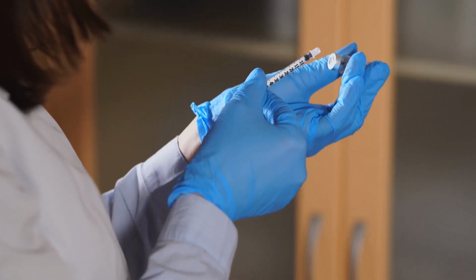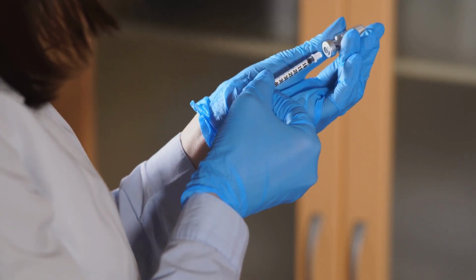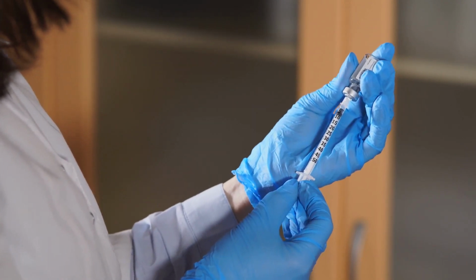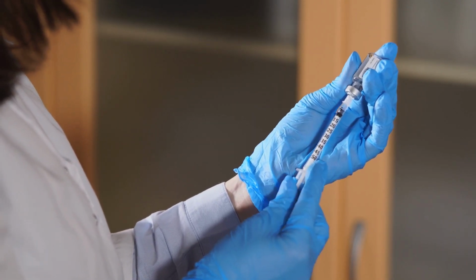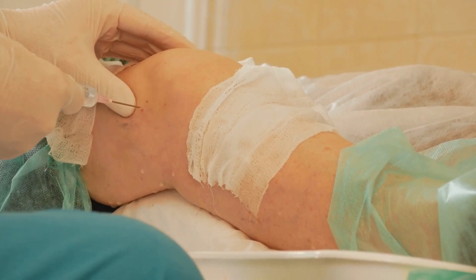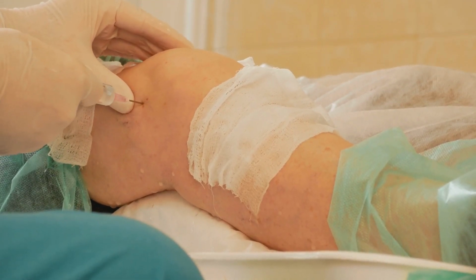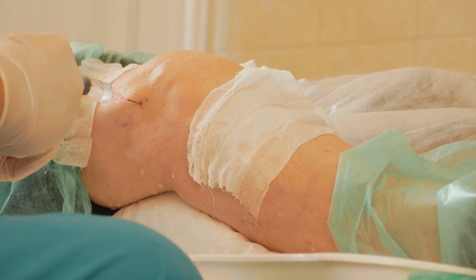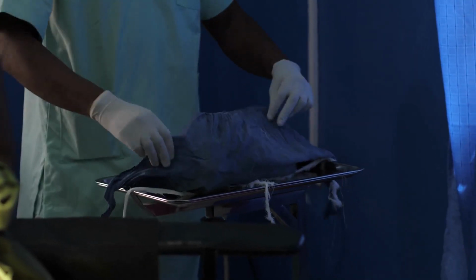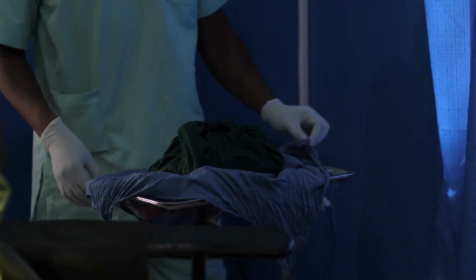The anesthetist attaches a syringe filled with air or saline to the epidural needle. As the needle is advanced, the anesthetist periodically attempts to inject the contents of the syringe. While the needle is in a ligament, the resistance to injection is high. However, once the needle enters the epidural space, the resistance drops significantly, allowing the contents of the syringe to be easily injected. This sudden loss of resistance indicates that the needle has entered the epidural space.